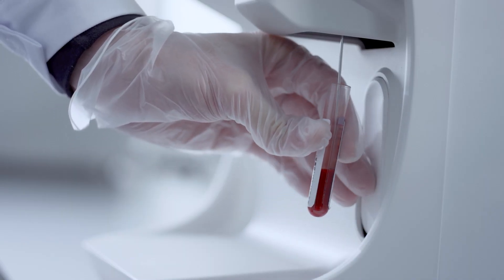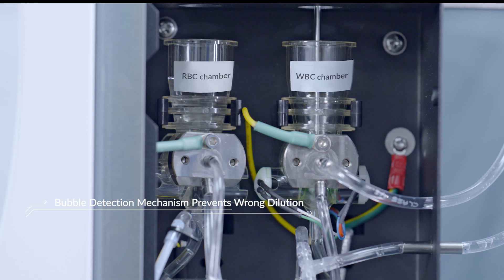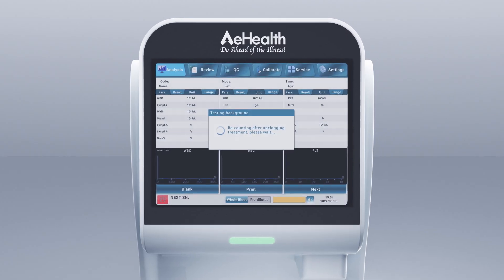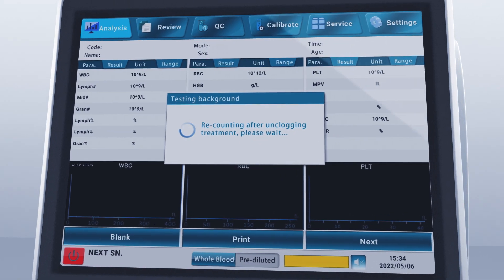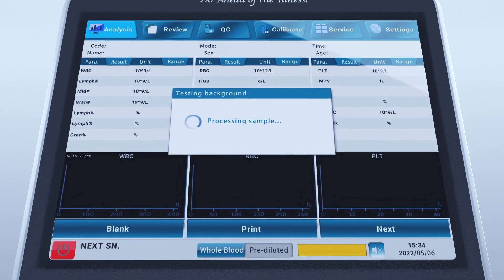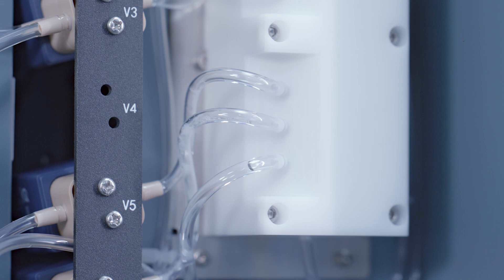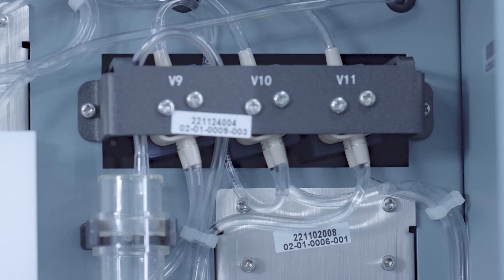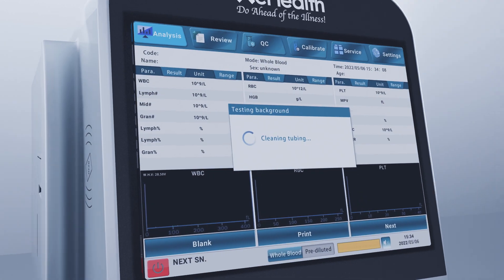The nano-coating sampling needle can avoid residue liquid hanging and reduce carryover pollution. When a clot suddenly occurs in the sampling needle and interrupts testing, the instrument will automatically self-check and remove the clot. After the clot is eliminated, the test will continue from the last point without re-sampling or additional reagent consumption.